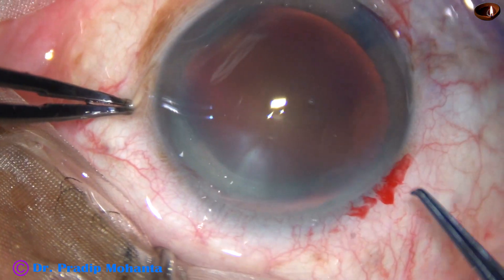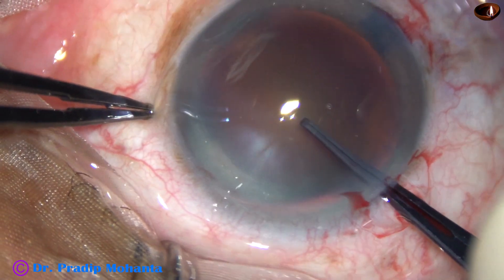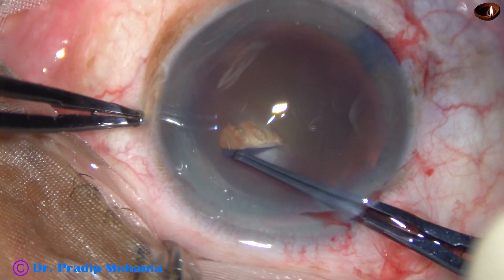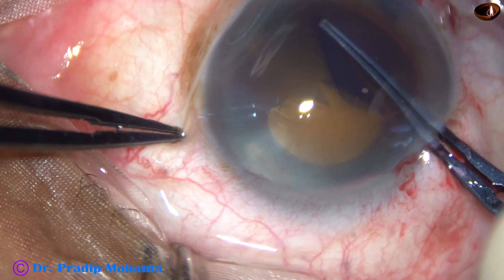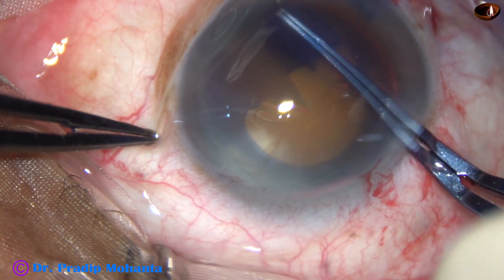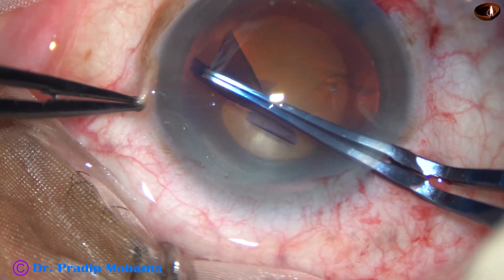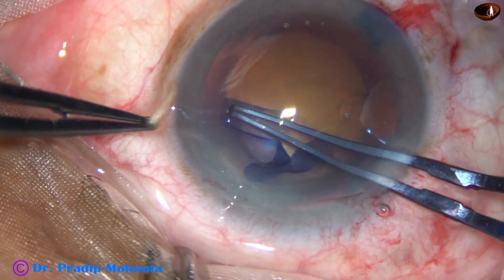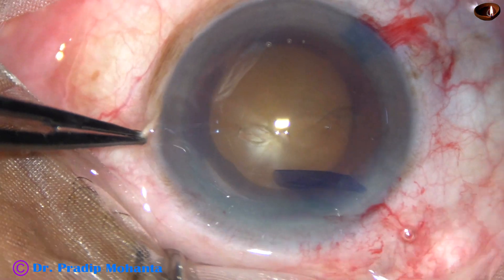This is capsulorhexis with the help of Utrata forceps. The anterior capsule is scratched and a capsular tag is raised. This capsular tag is moved anticlockwise all around, remaining at a certain distance from the margin of the dilated pupil. A round rhexis is obtained, with a size of about 5.5 mm.